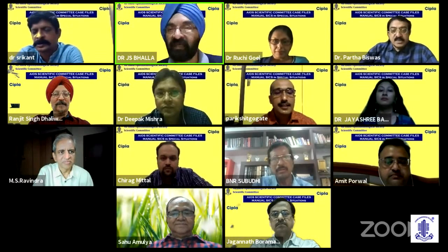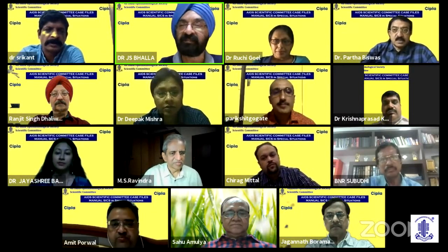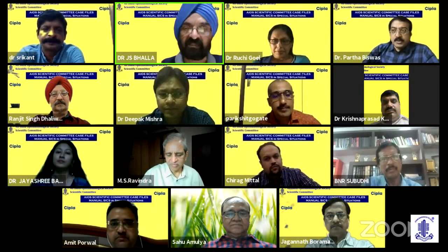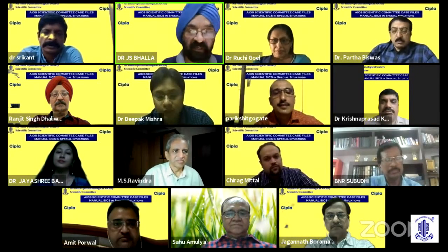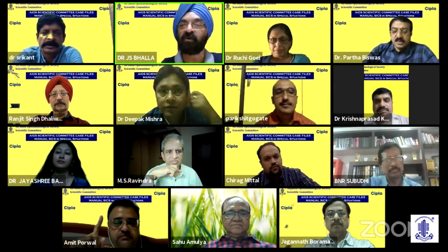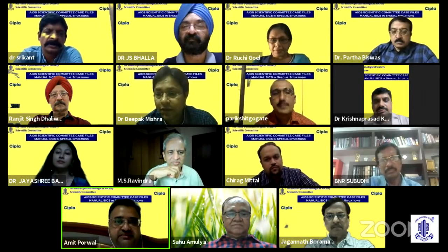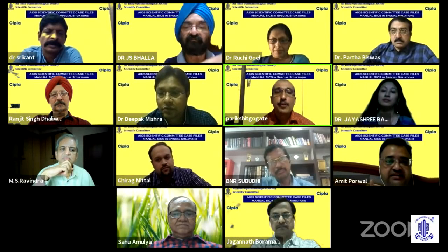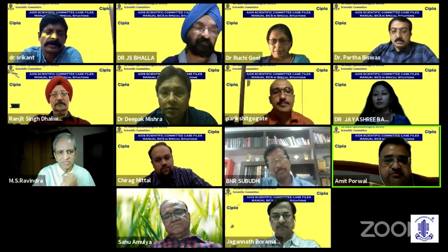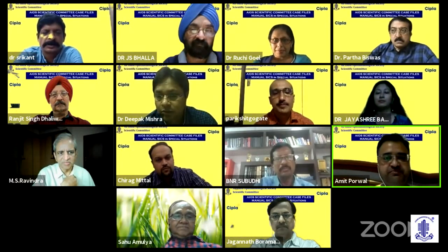I agree with Dr. Ruchi. Only thing is, I'm more in favor of doing two-site surgery rather than single-site surgery, for the simple reason that it causes less trauma and fewer chances of bleb failure in the subsequent period. Otherwise, I think it's a very well done surgery in Dr. Ruchi's hands. I would again go for a single site when it comes to SICS, because doing a twin site in SICS is a lot of conjunctival dissection. As a glaucoma surgeon, we would like to preserve as much of the conjunctiva virgin as possible. So when it comes to SICS trab, I would always prefer a single site.